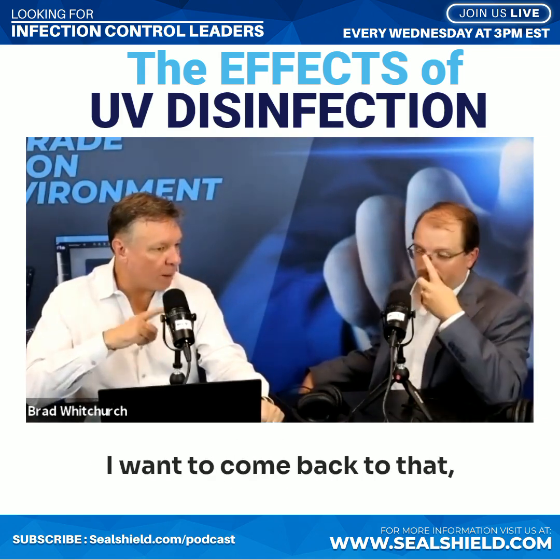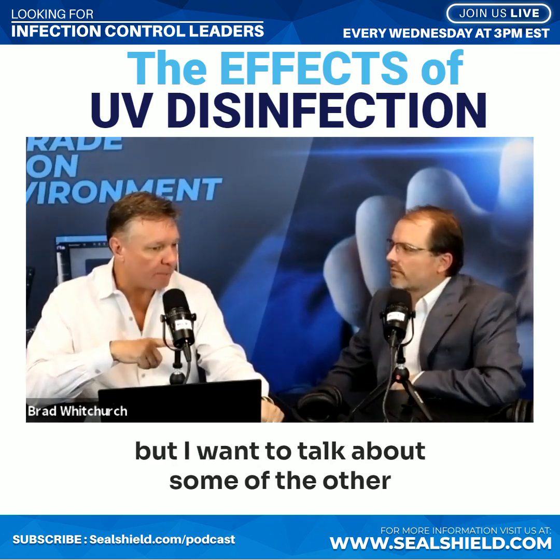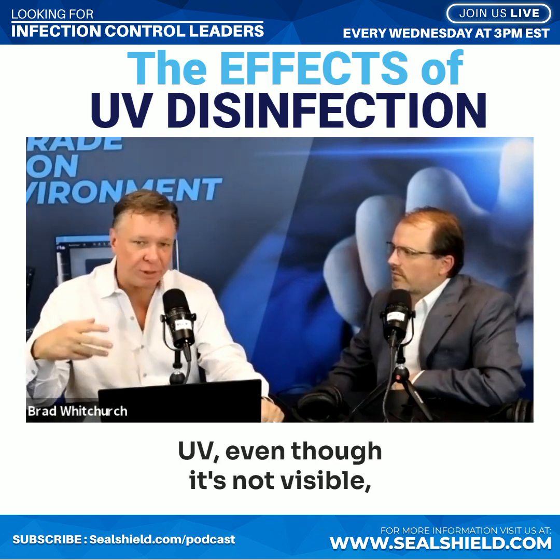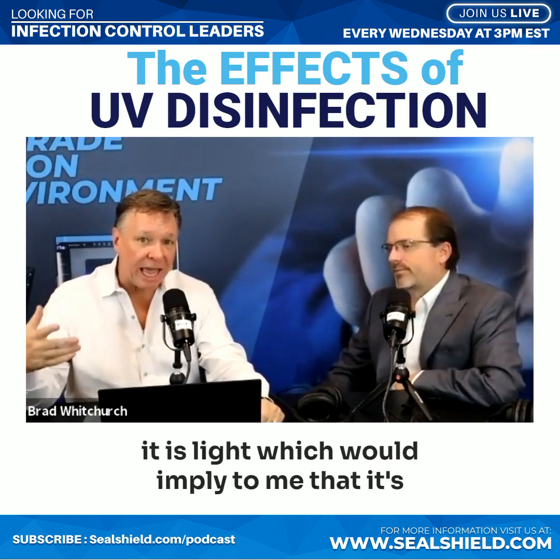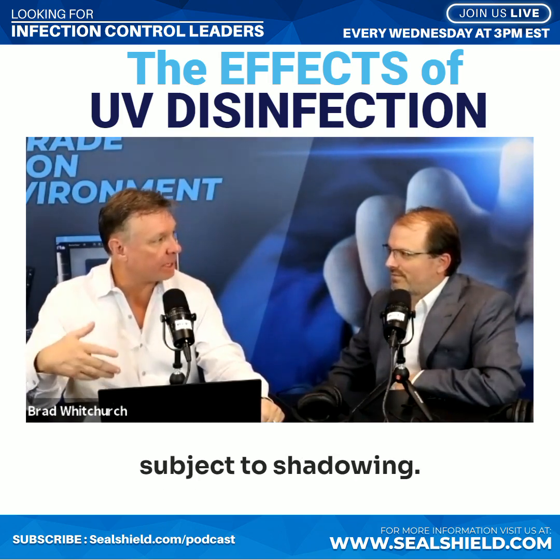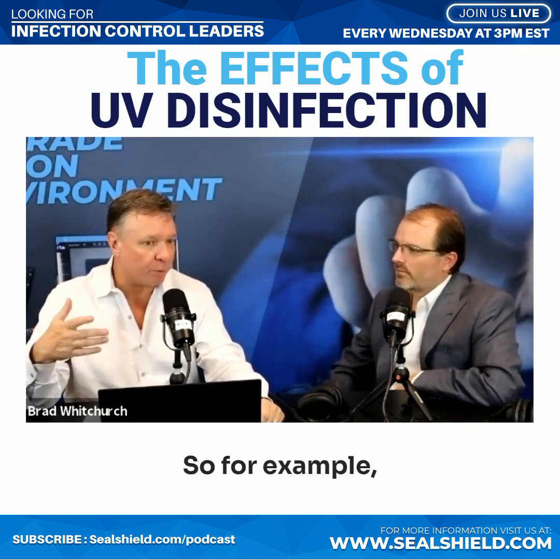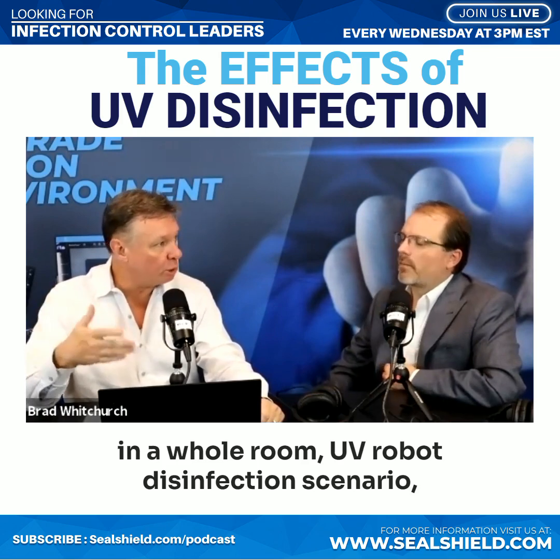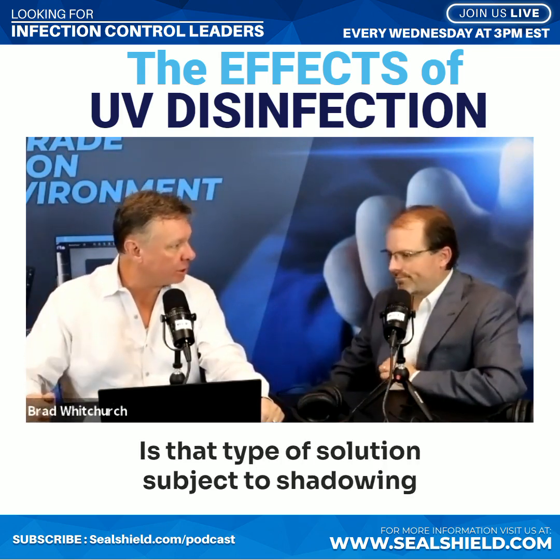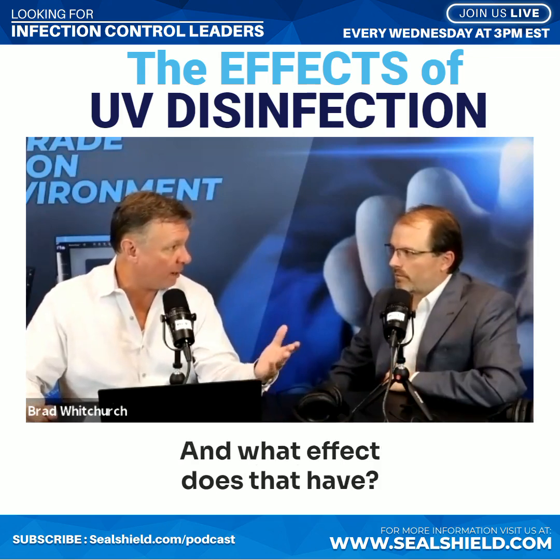Well, that's important. I want to come back to that, but I want to talk about some of the other potential limitations. UV, even though it's not visible, it is light, which would imply to me that it's subject to shadowing. So, for example, in a whole room UV robot disinfection scenario, is that an issue? Is that type of solution subject to shadowing, and what effect does that have?